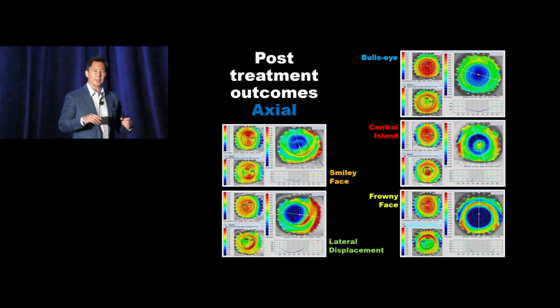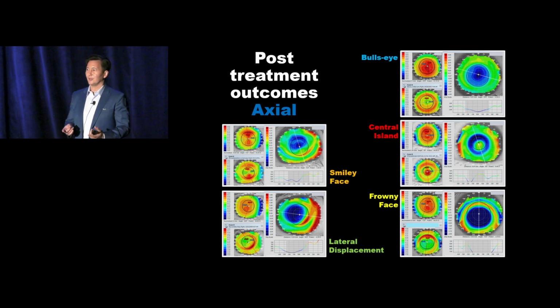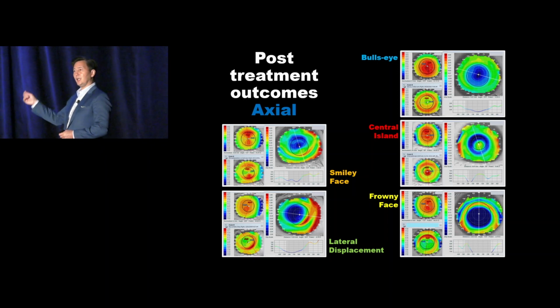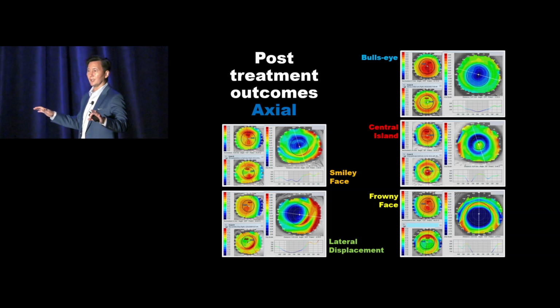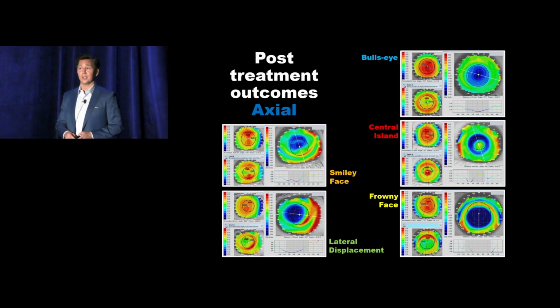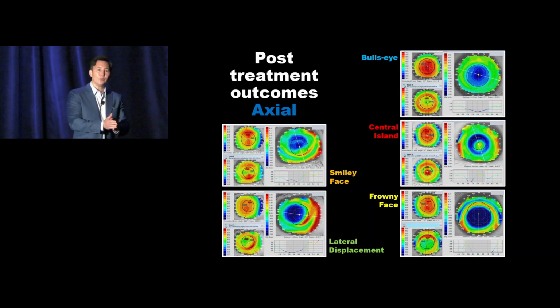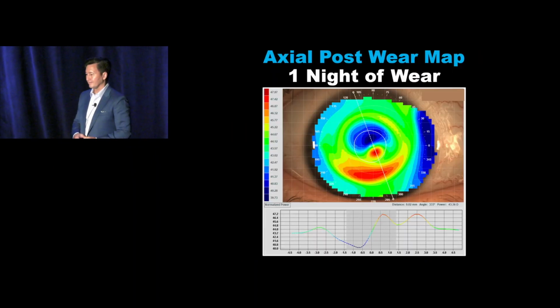If you've got a lens that shows no edge lift whatsoever, and you've got a patient that's uncomfortable with the fit, which one of the changes is going to loosen up the alignment zone? Which one is the steep fitting lens? That's the frowny face, right? So you can use all of these topographical responses to guide how you alter the lenses.